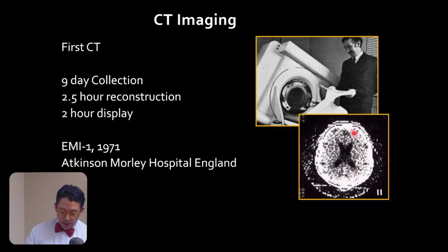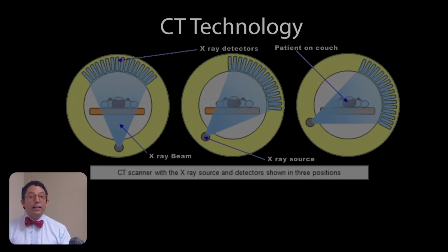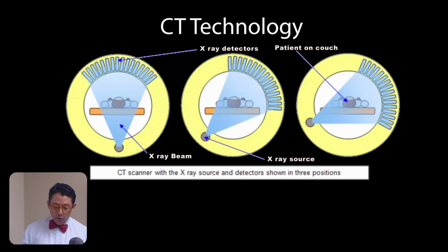And then you also have some space in the sides, which is kind of the brain parenchyma. And there's a little bit of a wider rim, and that wider rim is the skull. That was the first time you could see that. And it was absolutely amazing. But look at how long it took.